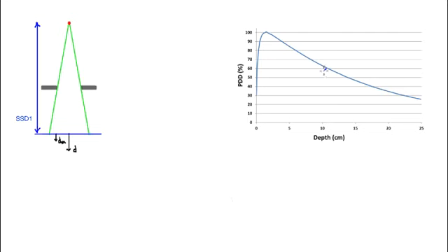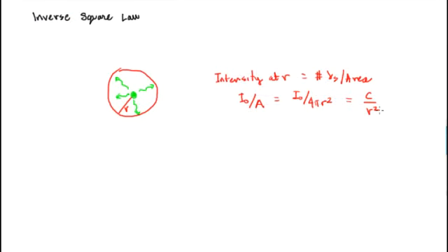So let's look at the fall off region of this PDD curve. First of all, there's the effect of attenuation, so e to the minus mu x. That's just the beam being attenuated exponentially. There are also effects from scatter. We talked about that last time. There are effects also from inverse square. This last one is particularly important, so remember this discussion. This was showing that the dependence falls off as 1 over r squared, because the area falls off. And that's from video 4.2, so you can go back and review that if you need to.